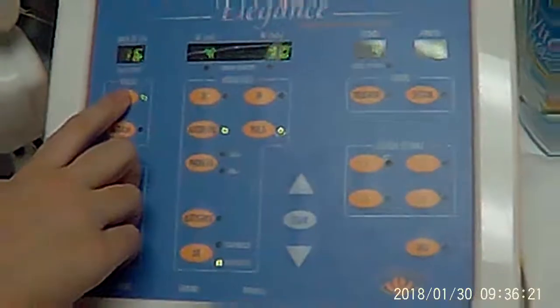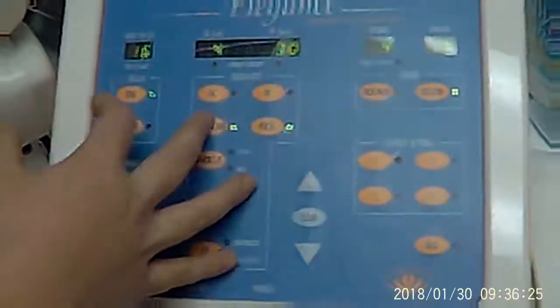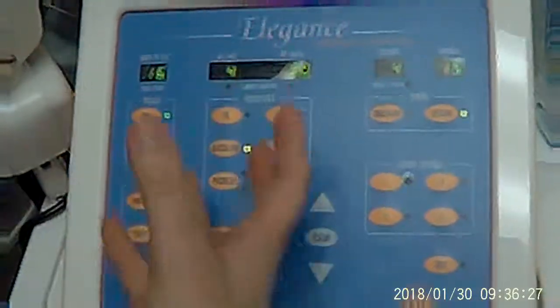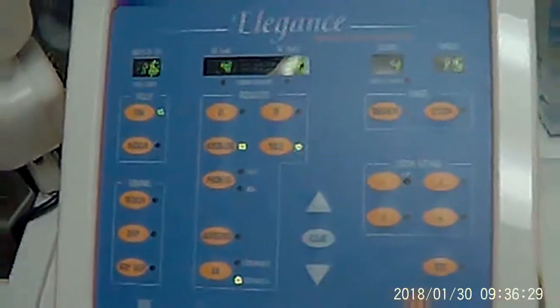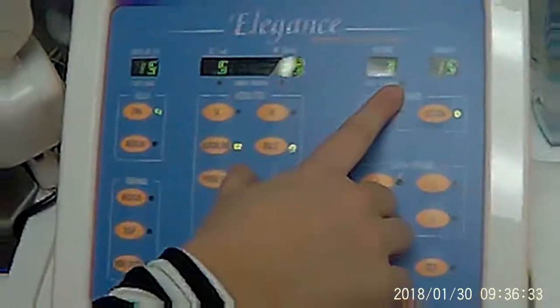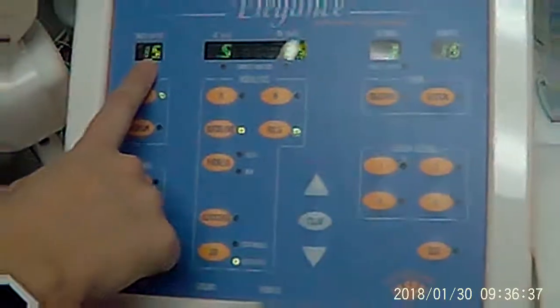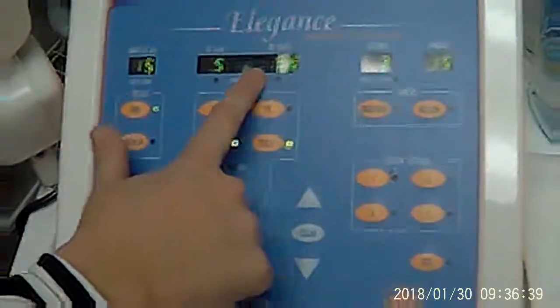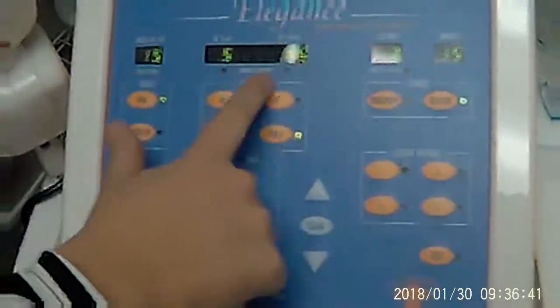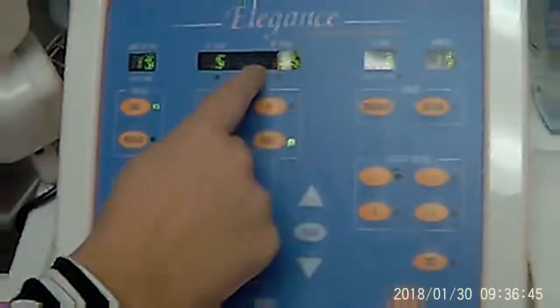But you can hit it a couple of other times. Say you want to do four seconds — say somebody had a lot of peach fuzz. You could go four, or there's one for three seconds. Sometimes I use the three. And that does 0.5 DC and gives you 15 units of live. But again, you're not at 30 — it's going to be a margin of error about 10 to 15 on the radio frequency units.